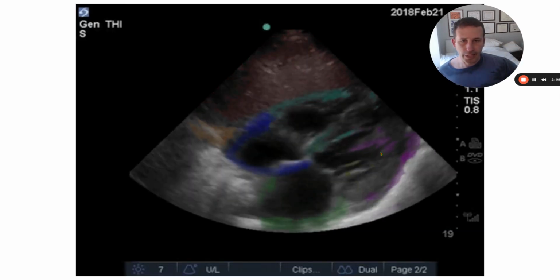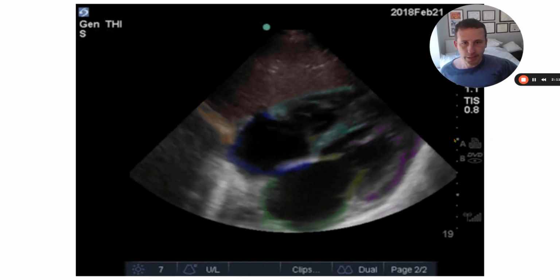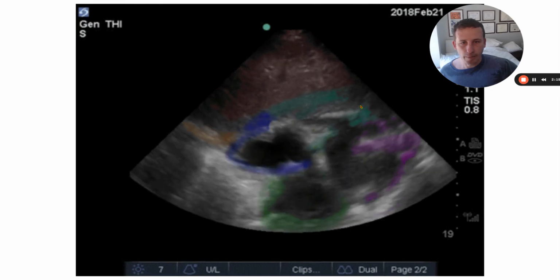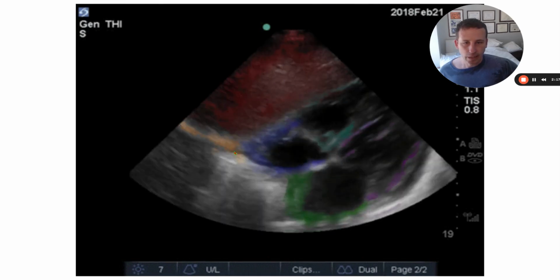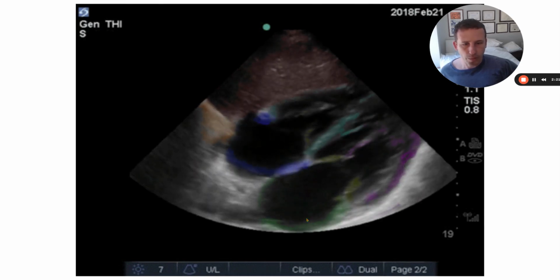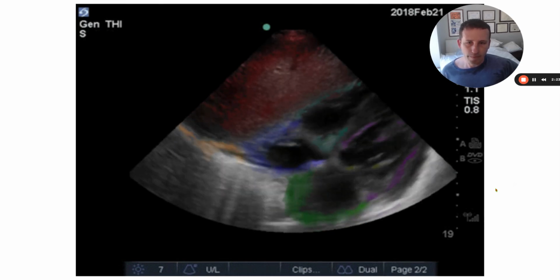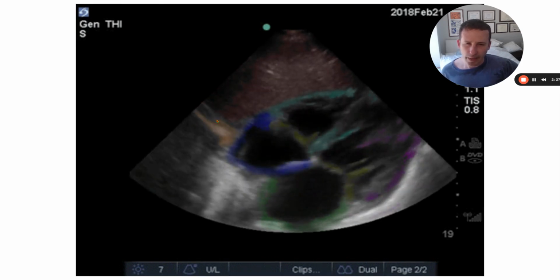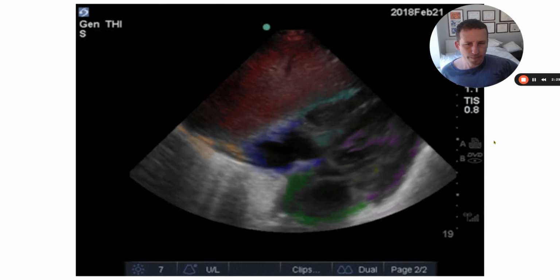So here's our colorized anatomy. Shout out to POCUS Atlas. We've got liver here in the near field. Our teal outline is for the RV. Then blue is the RA. And then deep to that, we've got our LV in purple and our LA in green here. And then they're also sort of marking off the diaphragm, it looks like, with the orange.